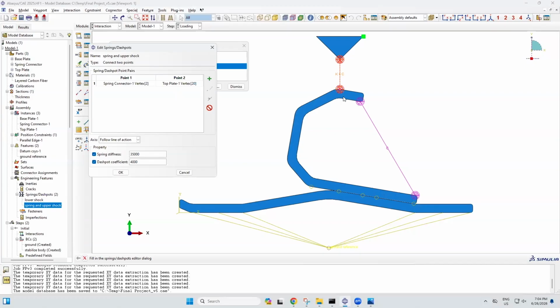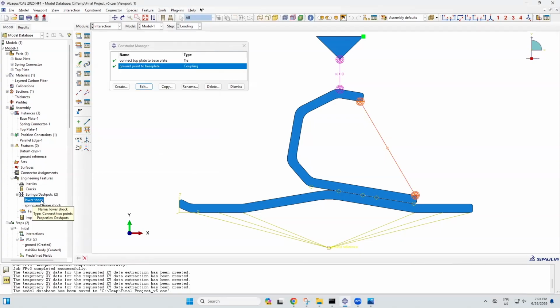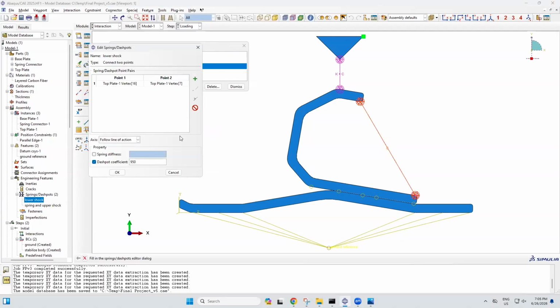I added a dampener or shock absorber to create a more lifelike scenario where the spring will be compressed when a person is standing on it. The spring stiffness was 35,000 and the dash pot or dampener coefficient was 4,000. The next dampener I created was the lower shock, and it has a dash pot coefficient of 950.